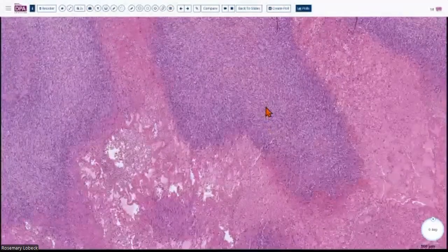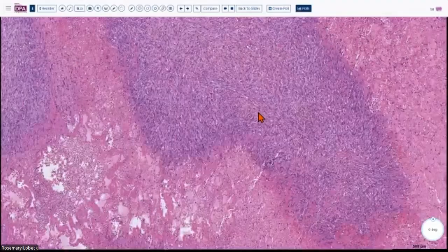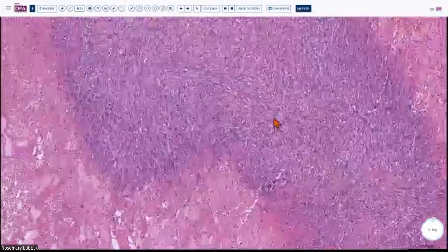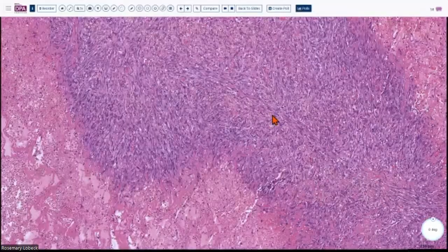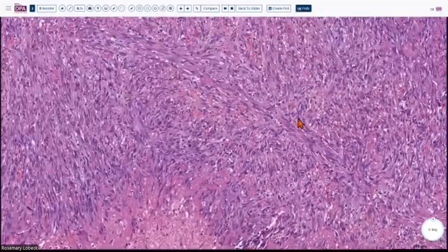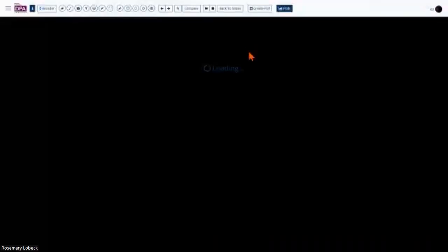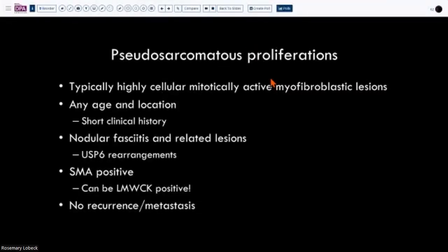Another pitfall in this, if we don't have enough pitfalls right now, is the fact that these can be positive for keratin, right? So you do a pan-keratin, like an Oscar or AE1/AE3, some cases can be strongly diffusely positive because myofibroblasts have the tendency to exhibit low molecular weight cytokeratin positivity, right? So if you are worried about sarcomatoid carcinoma, then you try some other markers, other keratins which don't have the low molecular weight cytokeratins, or you just add an SMA and you will see that this is all positive for SMA.